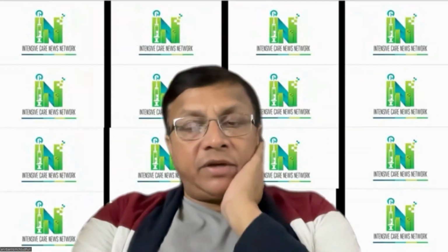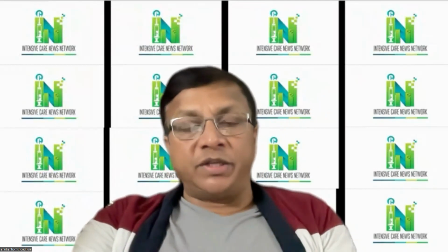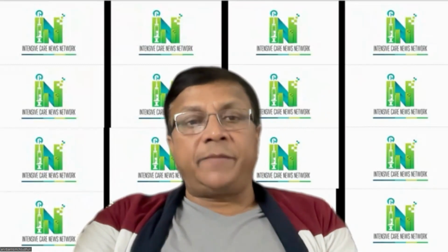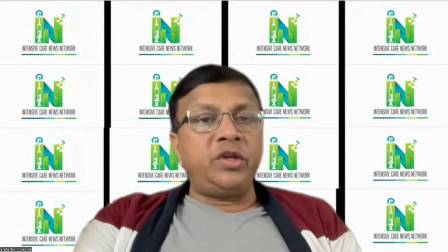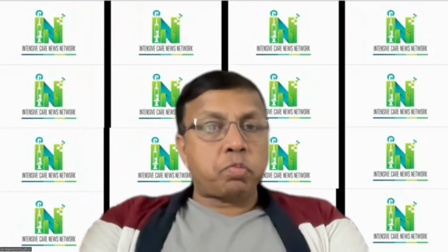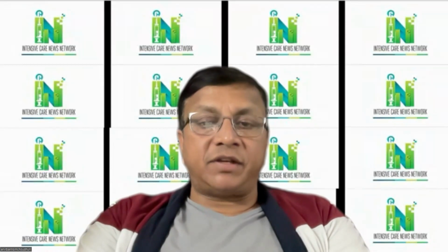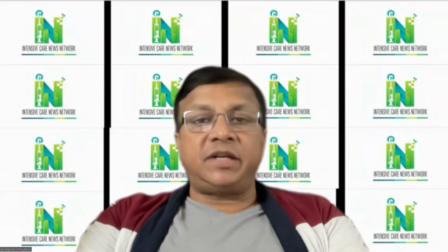Tell me, Ankita, when we know that extracellular water is how much and intracellular water is how much, now, out of that extracellular water, how much is intravascular and how much is extravascular? Which parameters will indicate that? Sir, actually, it will just tell us about the fluid status, not the vascularity. No, I'm talking about how much of that fluid is inside the vessels and how much it is outside the vessels. So we give the separate ratio of intracellular and extracellular water.